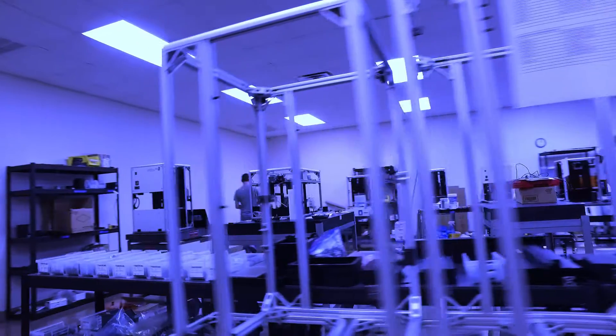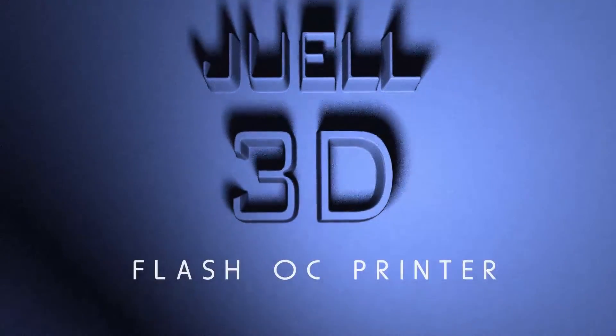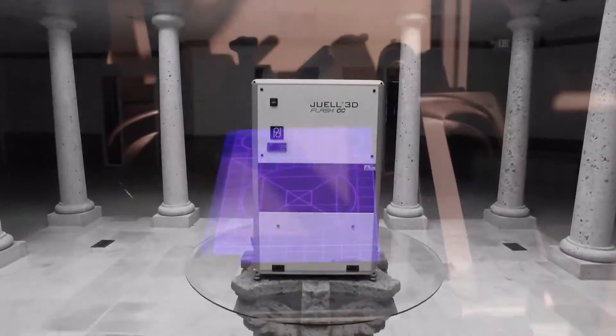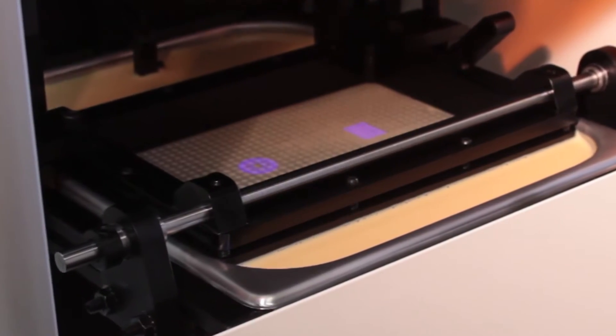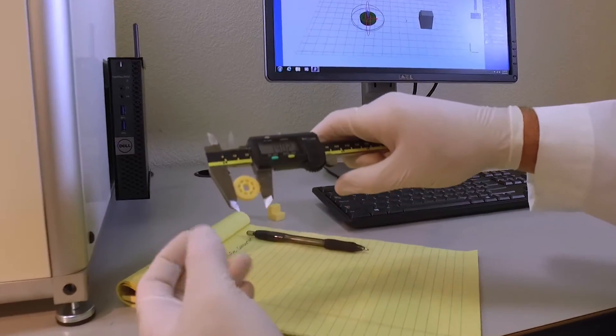From Park Dental Research comes the Juell 3D Flash OC printer, designed specifically for the dental industry. Unlike most 3D printers, the Juell Flash OC builds its 3D models on a patent-pending oxygen permeable mask, a technology unavailable from its competitors. This unique process creates smooth surface models of high resolution and precise anatomical accuracy.